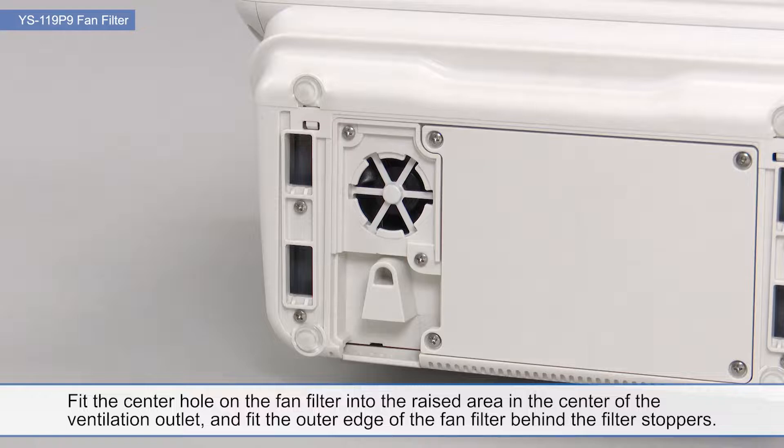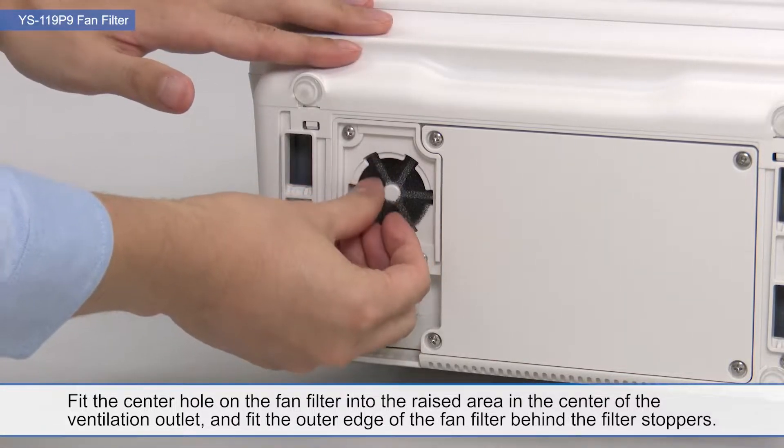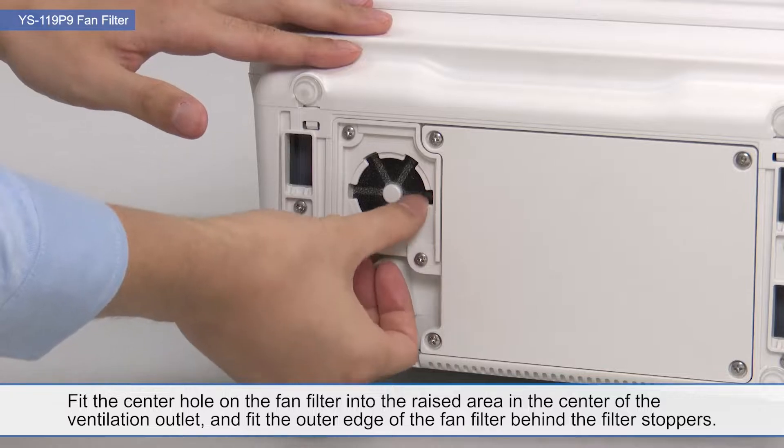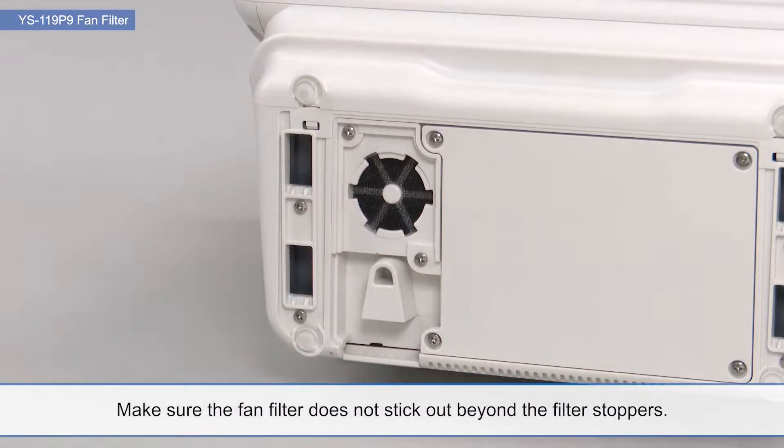Fit the center hole on the fan filter into the raised area in the center of the ventilation outlet, and fit the outer edge of the fan filter behind the filter stoppers. Make sure the fan filter does not stick out beyond the filter stoppers.